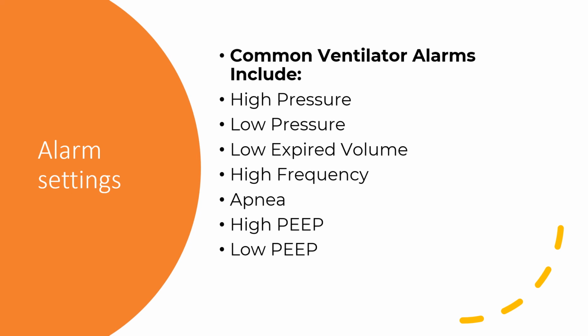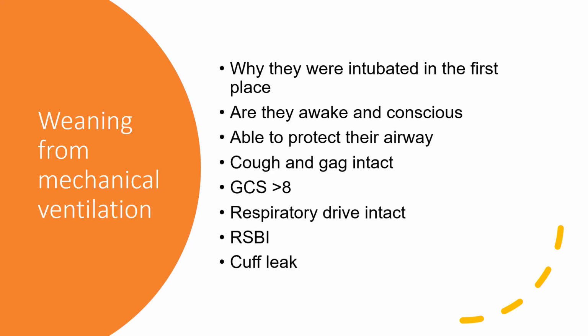So when you set a patient up on mechanical ventilation, you cannot forget to set up the ventilator alarms because they're very important, and don't ignore these alarms because it could be life-saving. So I have a slide here talking about weaning from mechanical ventilation.